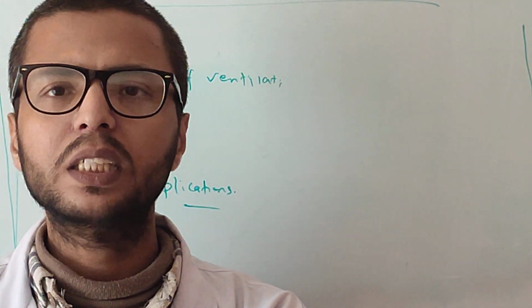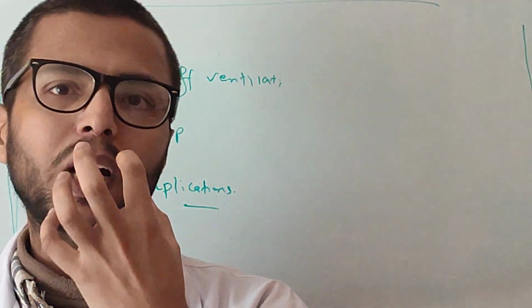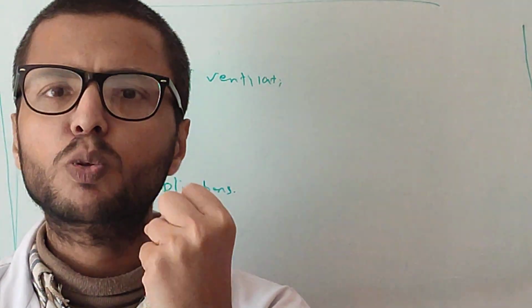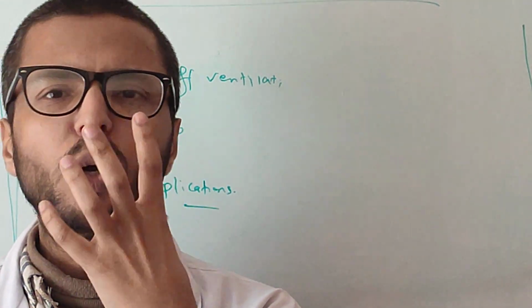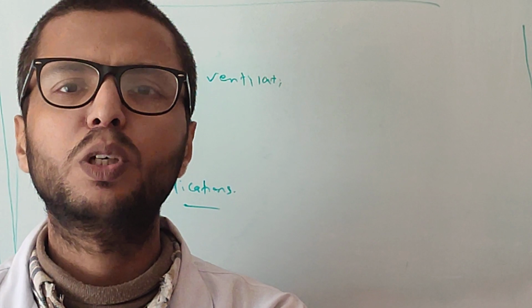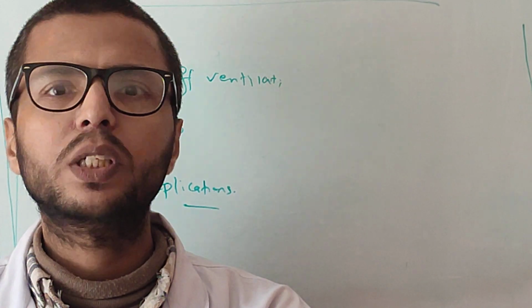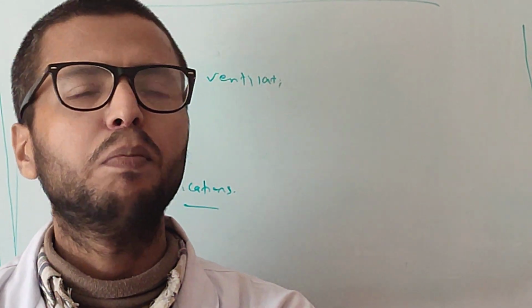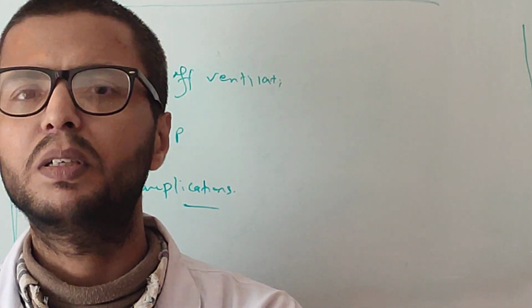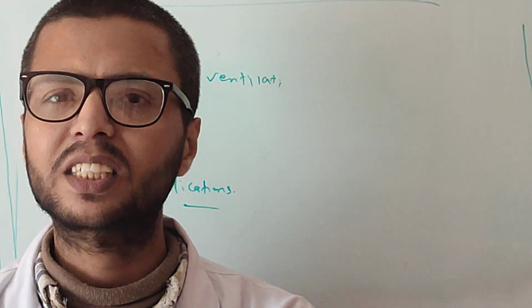So what are the complications? One is interface complications, another is from the pressure, whatever pressure you apply on the face. And another is that due to inadequate humidification, nasal dryness and congestion can occur. So you may need to give decongestants and humidified oxygen. Consider those and watch for them, because those are common complications: nasal congestion, nasal dryness, and if you just adjust it, the patient can be comfortable. Those are minor things, but they matter a lot to the patient's comfort.